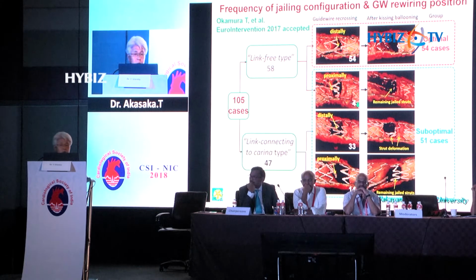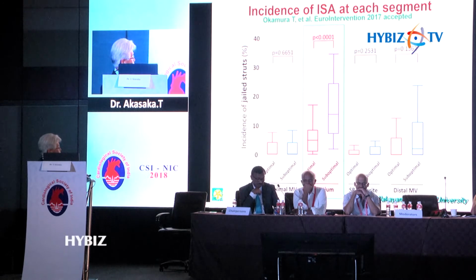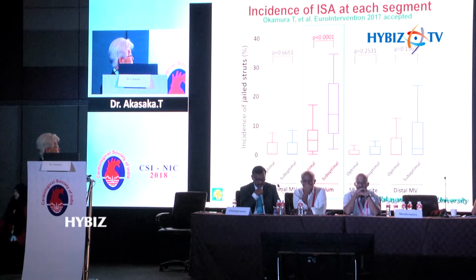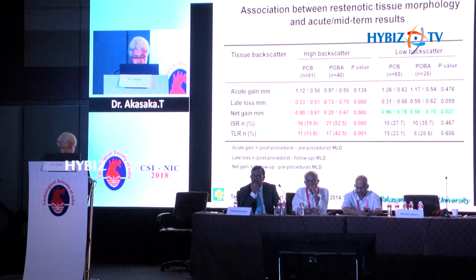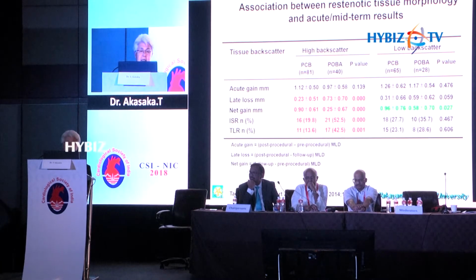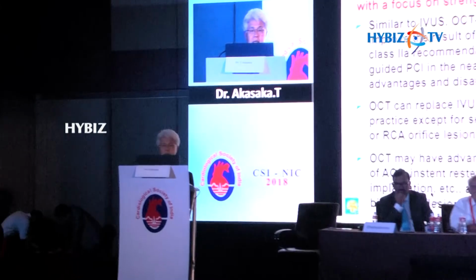We did not demonstrate any clinical difference. However, this is one of the jailed struts percentages. In suboptimal cases, there are lots of jailed struts at the orifice. And there is a tendency toward in-stent restenosis. Long-term follow-up demonstrates a much better result compared with the ordinary balloon. So you can decide based on such OCT findings, and this is already demonstrated.